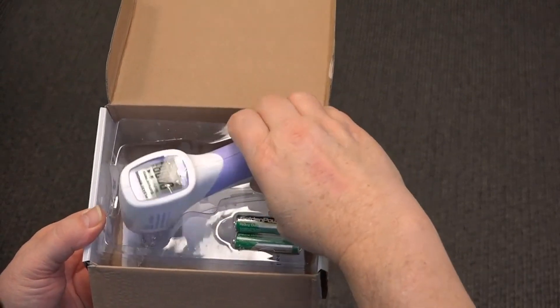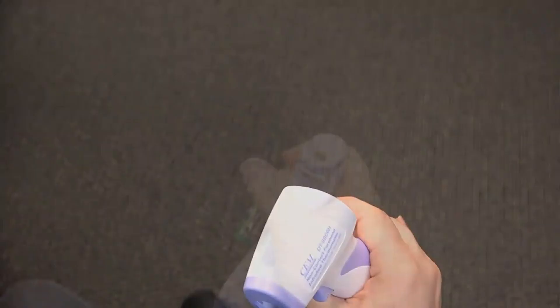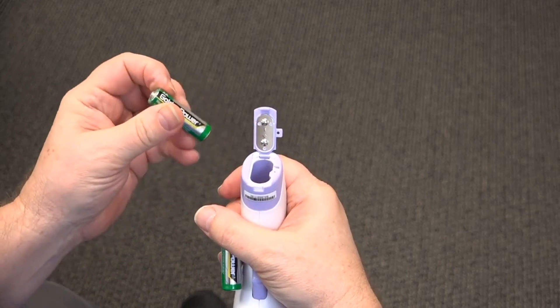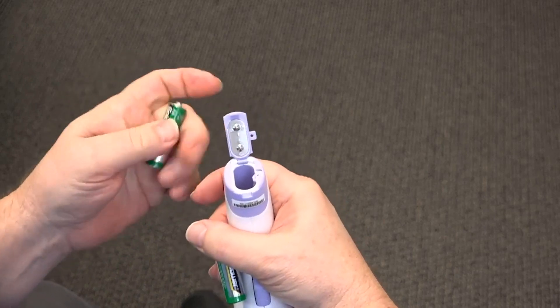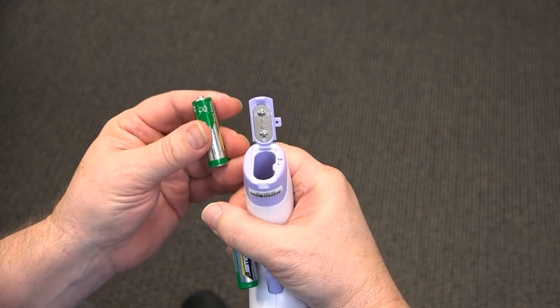Remove the thermometer from the box. It also comes with a set of batteries. Install the batteries into the base of the unit. Be sure to observe the polarity for the batteries.